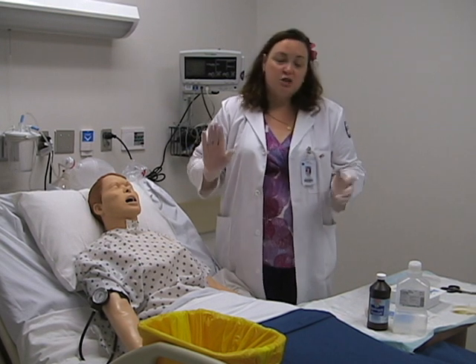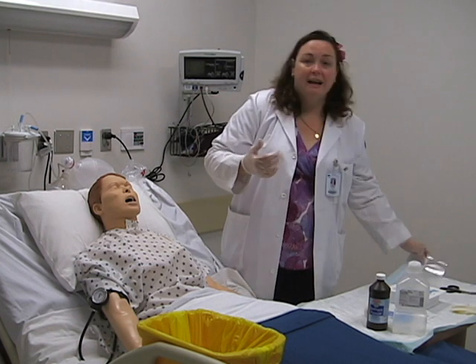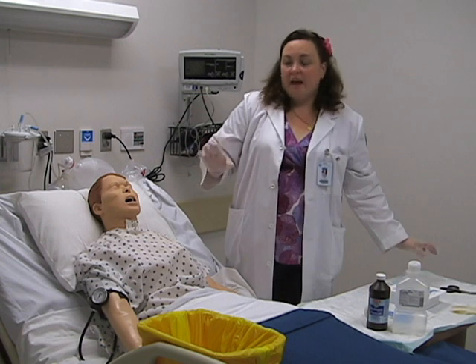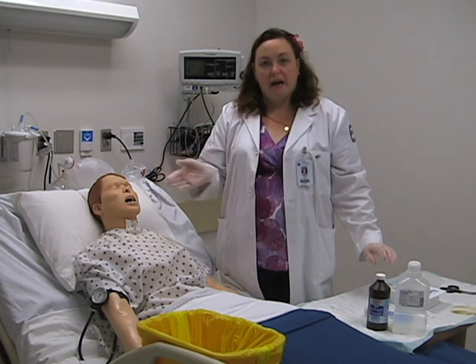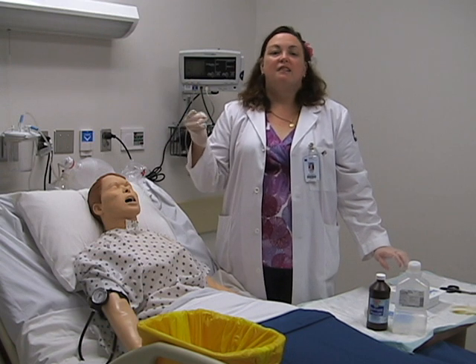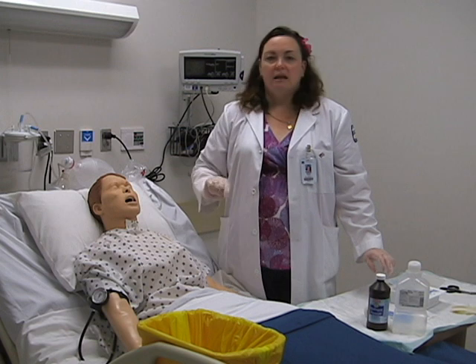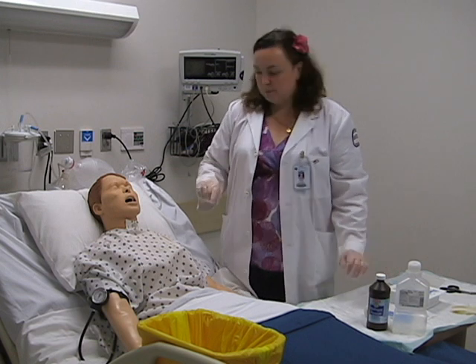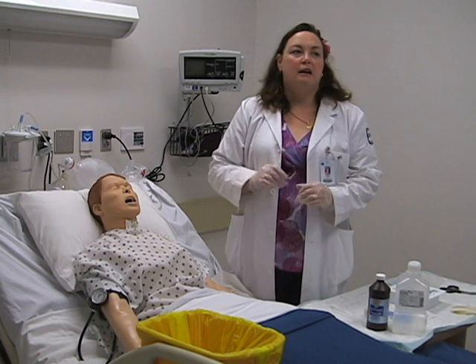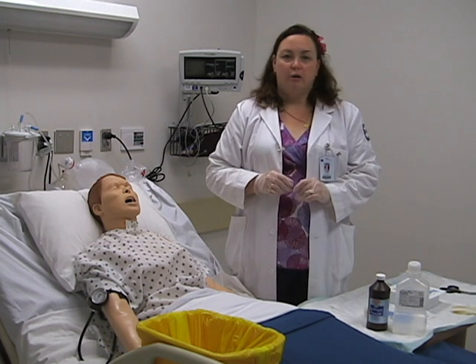You want to protect yourself not only with gloves, but also with a face shield or eyeglasses. Because with a tracheostomy, it bypasses your normal humidification center — the mouth, nose, larynx — the sputum gets very thick and tenacious. When you're doing tracheostomy care, you don't want to be leaning over in the line of fire, because the sputum can project anywhere from 6 to 10 feet away from the patient.